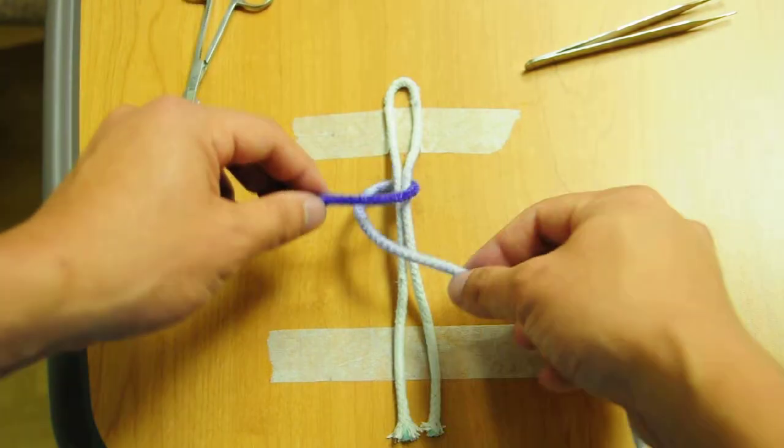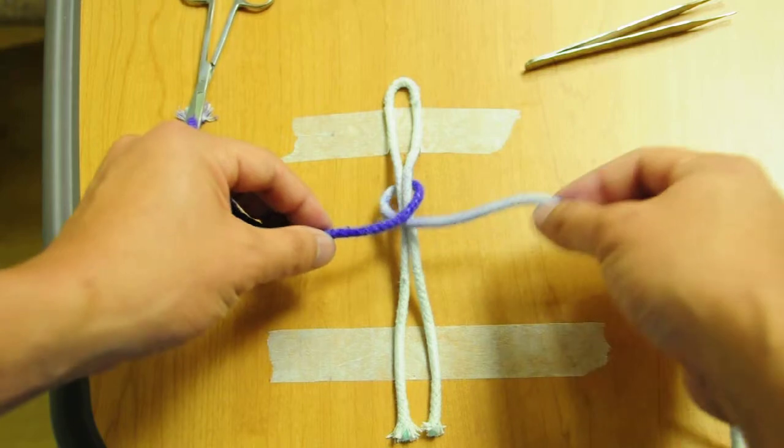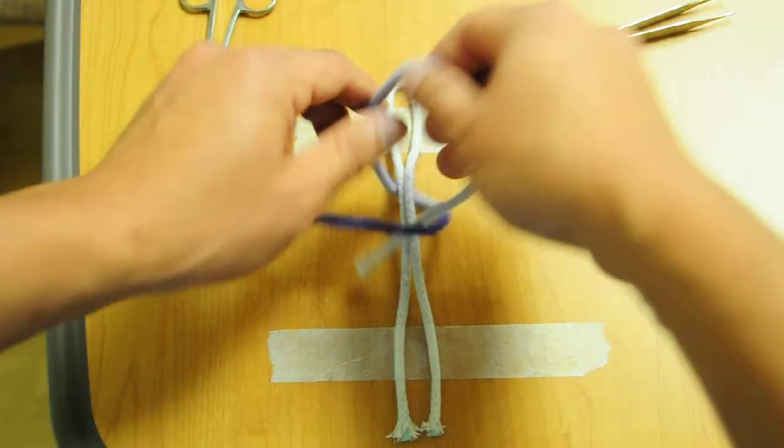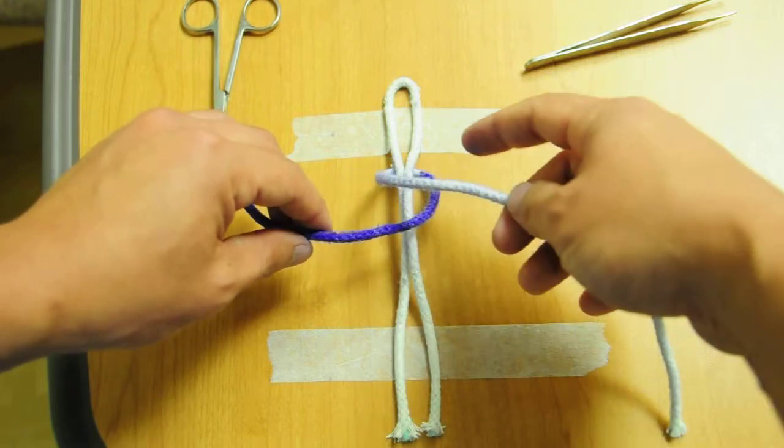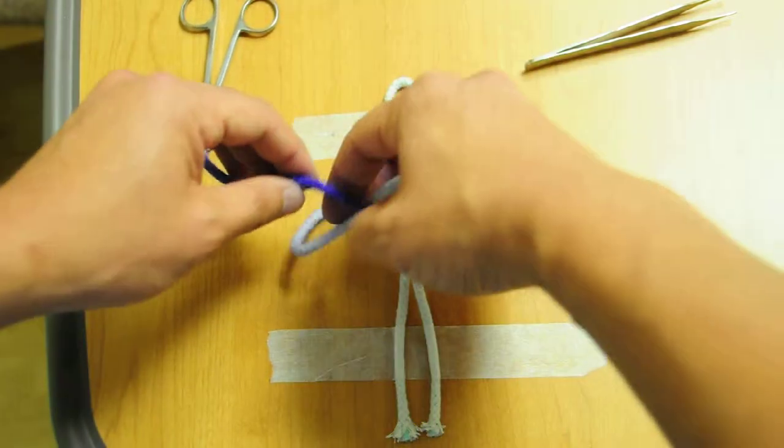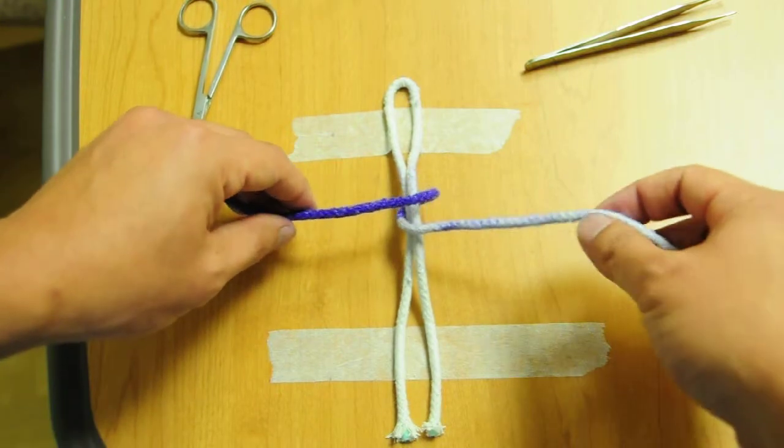You're stuck in this situation. Always see which strand is already laid out for you. In this situation, your free end is under. If the free end is over, you do an index finger one-handed tie. But if it was under, you'd have to start with your middle finger.